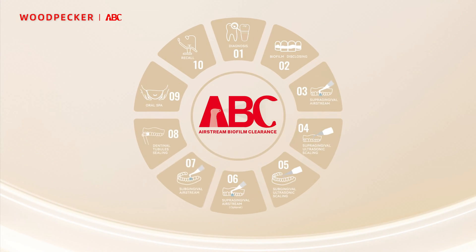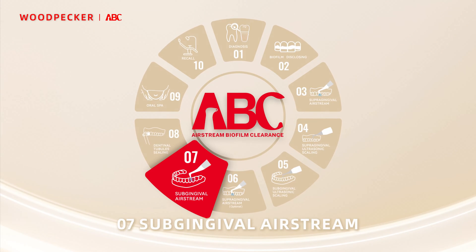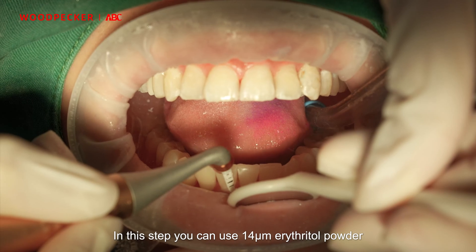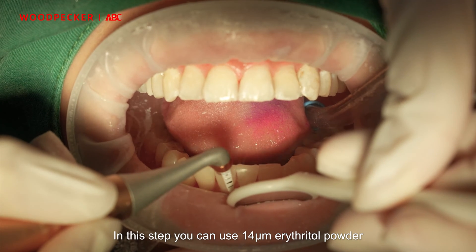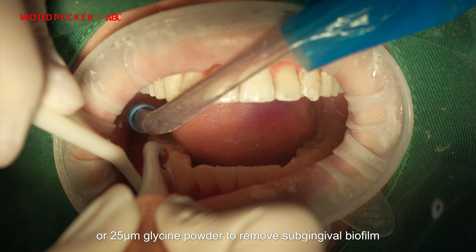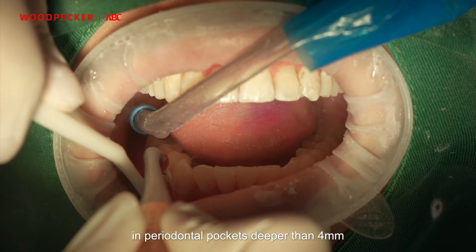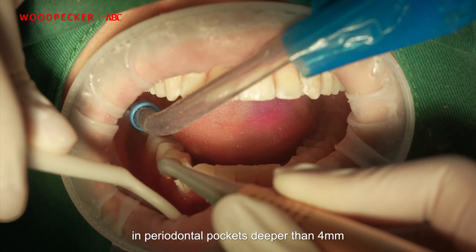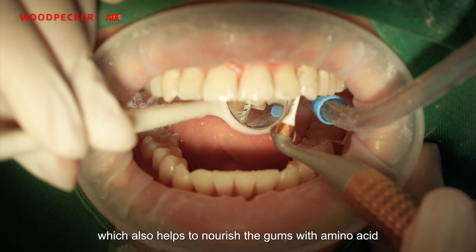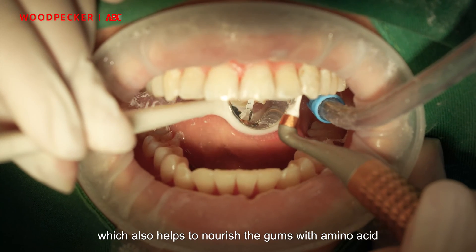Step 7: Subgingival Airstream. In this step, you can use 14-micrometer erythritol powder or 25-micrometer glycine powder to remove subgingival biofilm in periodontal pockets deeper than 4 millimeters, which also helps to nourish the gums with amino acids.